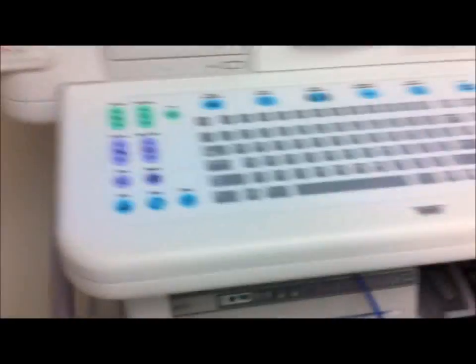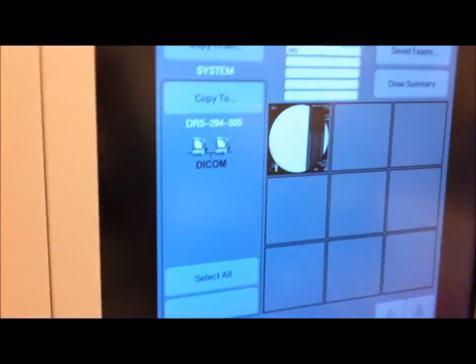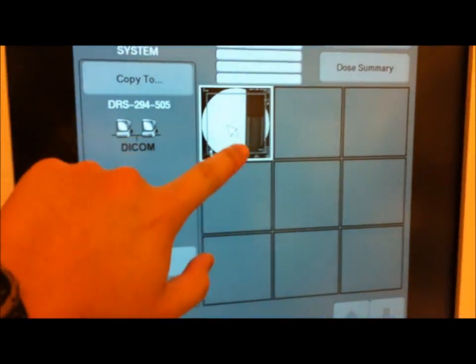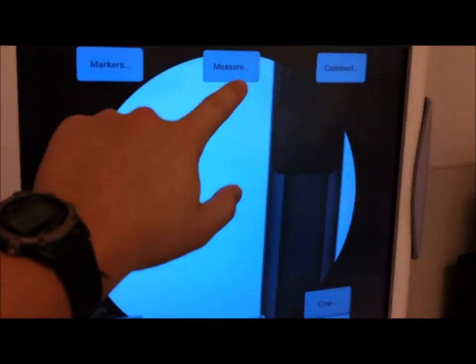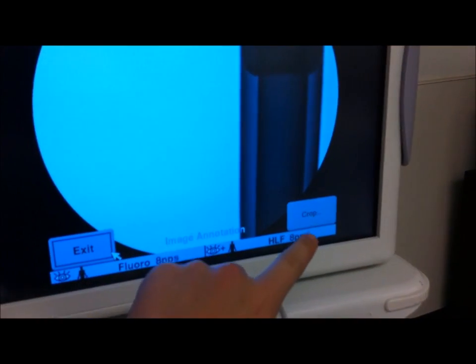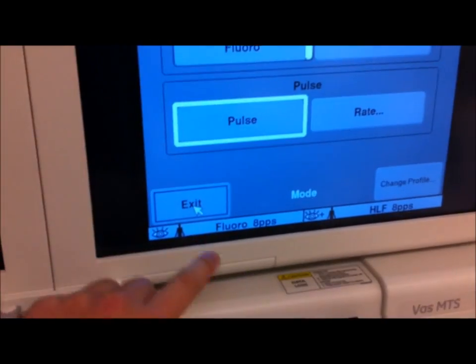The other functions on this particular C-arm: you can go to image directory here and you can see all images that you shot and saved — like particularly this one here. When you click it, it brings that image back up. And you have image annotation, so you can throw in markers, you can measure, you can even add in a comment, you can even crop the image. Let's exit since we don't need to play with this.